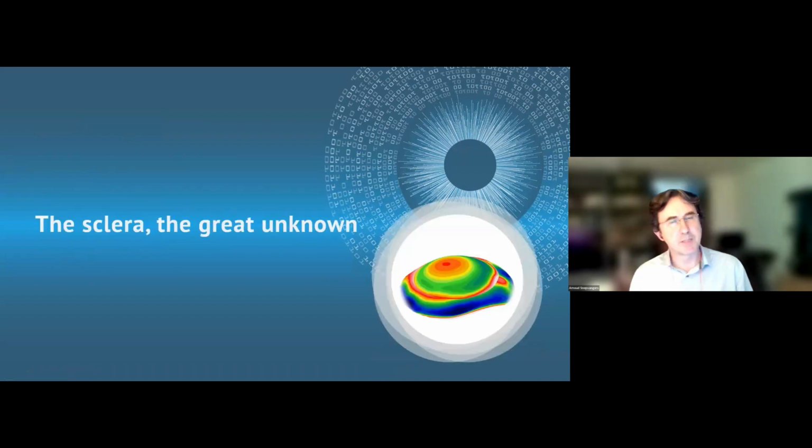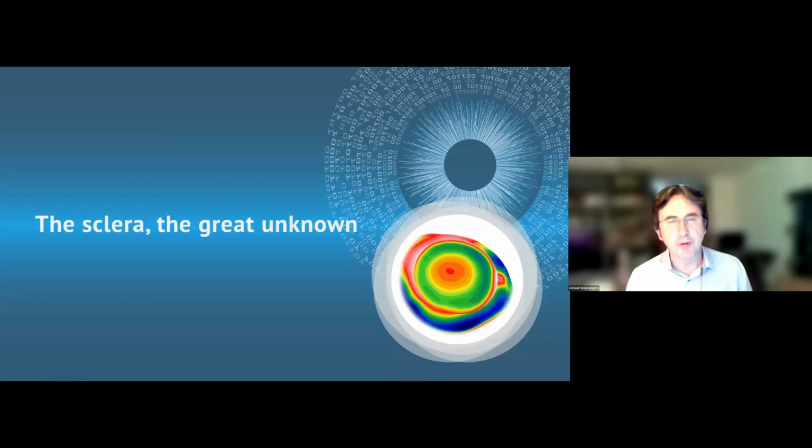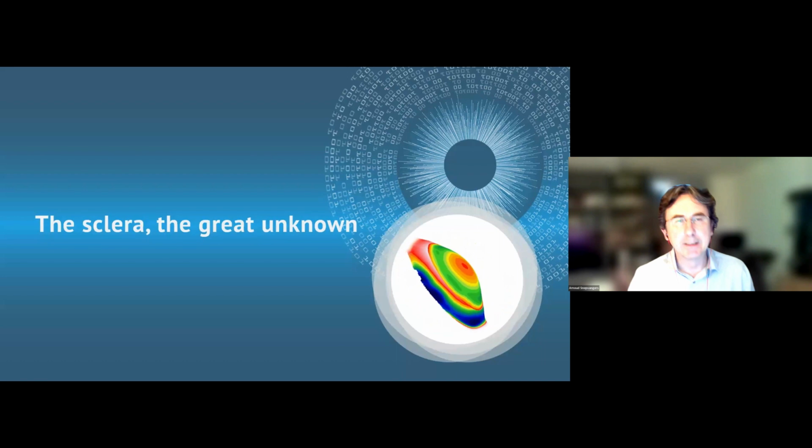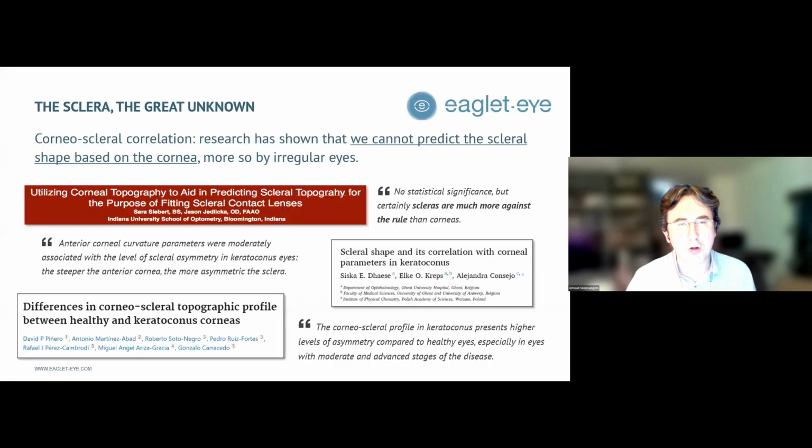So, as mentioned, just a short while ago, we knew very little about the sclera's shape. And it was thanks to the eye surface profiler and other devices that have come to the market since then, that in the last 10 years, we really have seen a lot of publications on the scleral shape.